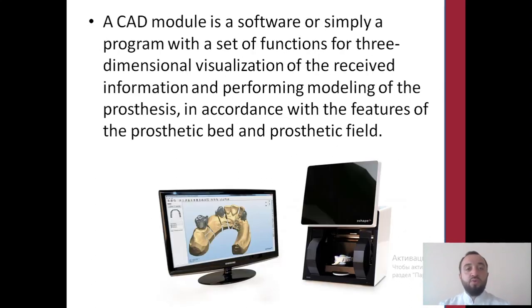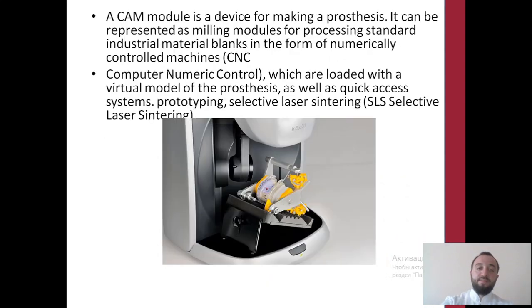A CAD module is software, simply a program with a set of functions for three-dimensional visualization of received information and performing modeling of the prosthetic in accordance with the features of the prosthetic bed and prosthetic field.